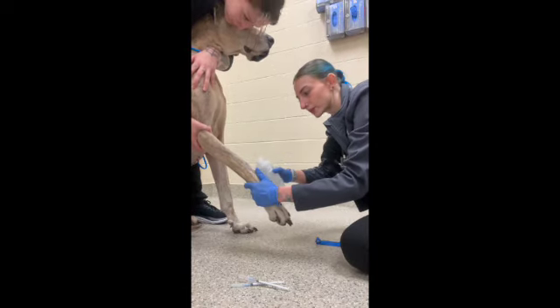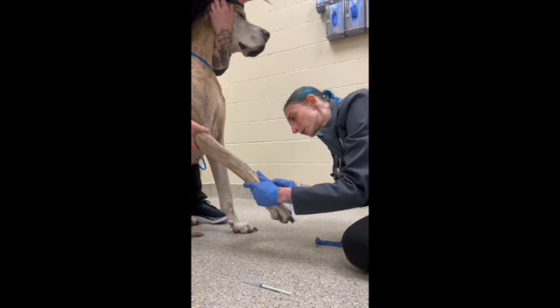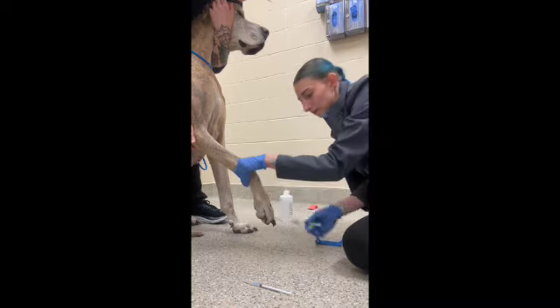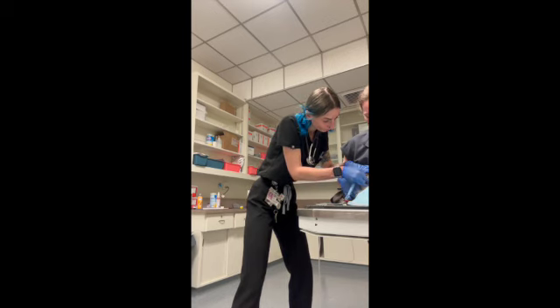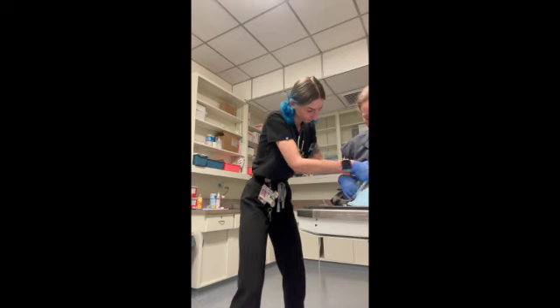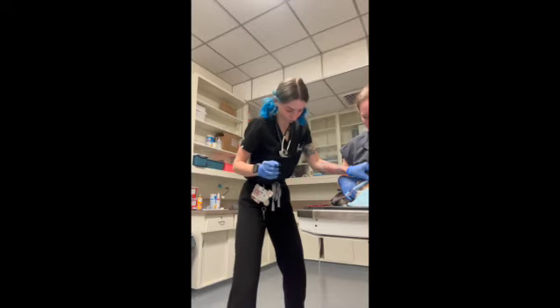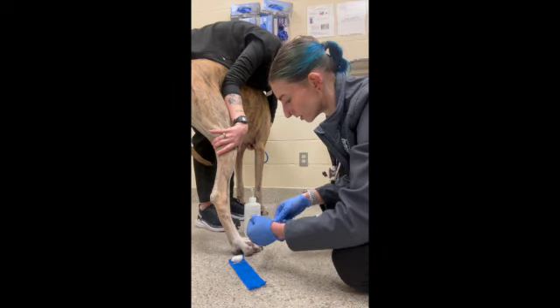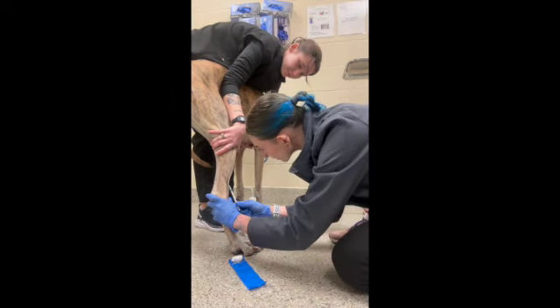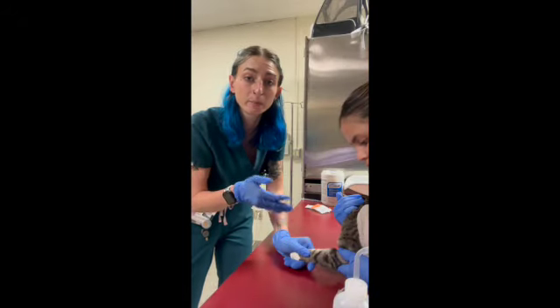Alrighty, we're gonna obtain blood from the cephalic vessel on your canine. So we're going to obtain our blood sample from the canine lateral saphenous. Cephalic blood sample from your feline patient.